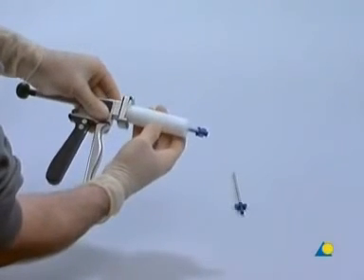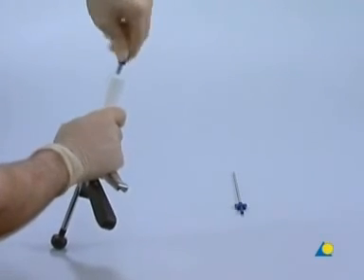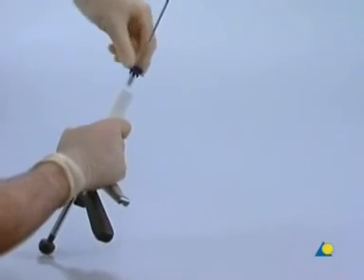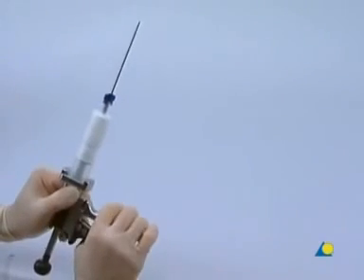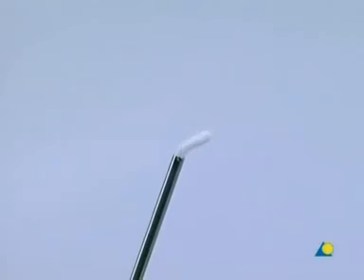The far end of the cartridge is loaded into the bayonet catch on the delivery gun. The blue sealing cap is removed, and the appropriate injection cannula is mounted. When the delivery gun is held upright, the remaining air is expelled from the cartridge by gently squeezing the trigger several times.